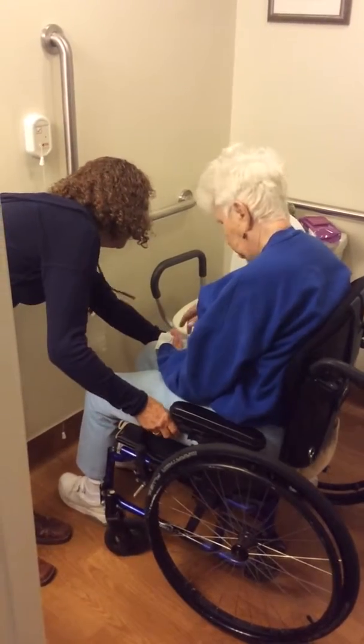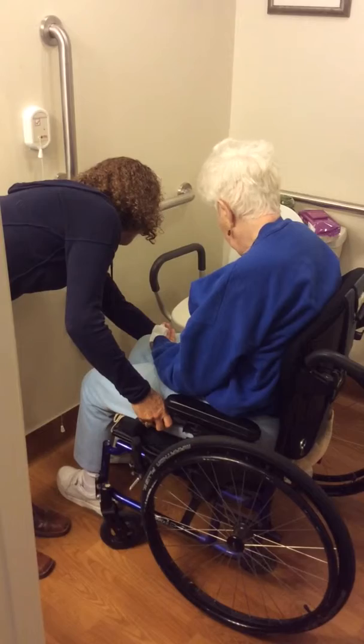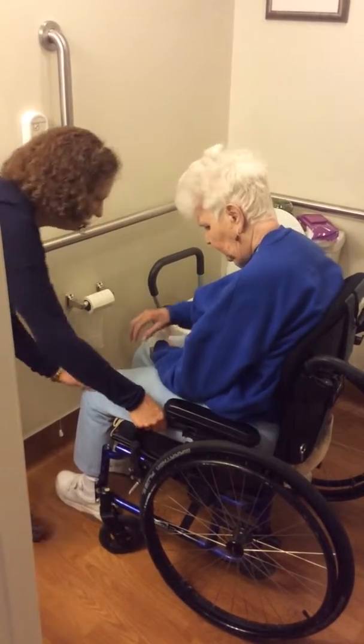Move them. Let me give you a little more room. Now lock the brake, push them down. Lock the other brake.